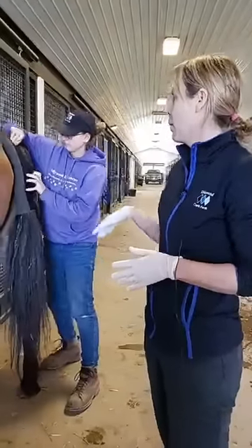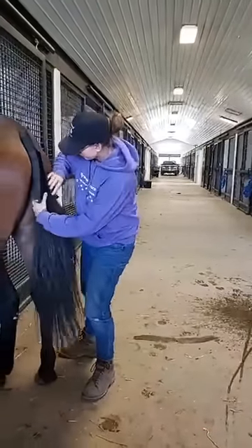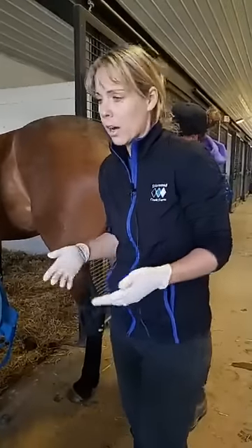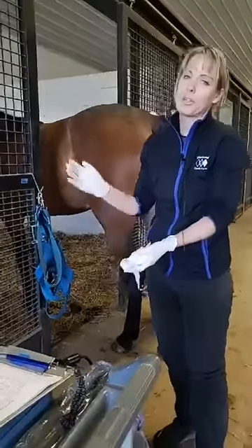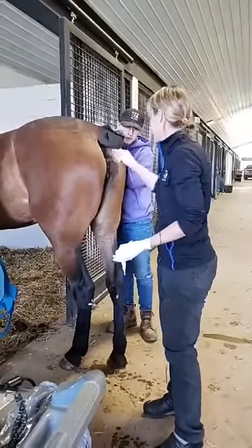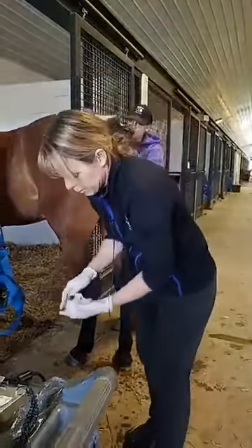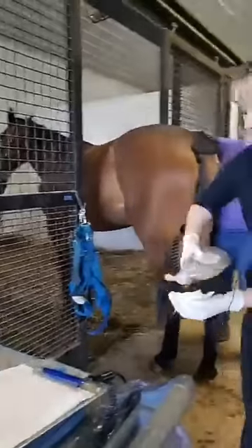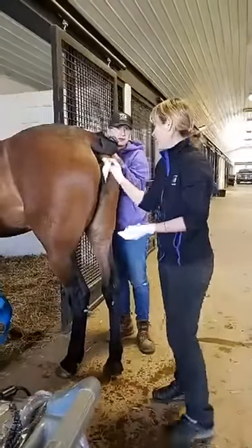Right now we're putting on a tail wrap to keep all the tail hair away from the vulva, and then we'll get ready to wash her. This is different than the stallions — with stallions we just washed with water and cotton. Here I use ivory soap. It's really gentle on the mares, and if we happen to drag a smidge of it in, it's not detrimental to the sperm. So I'm just going to clean her up — first a little wipe to get some of the excess debris off, and then we're going to wash the vulva with ivory soap.